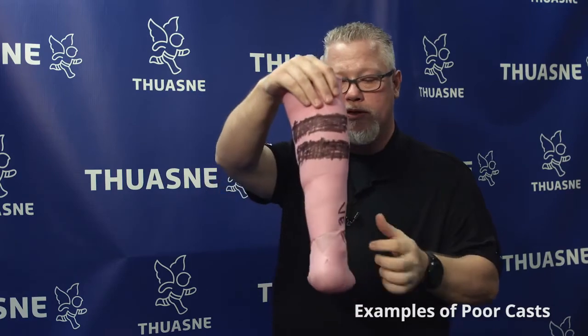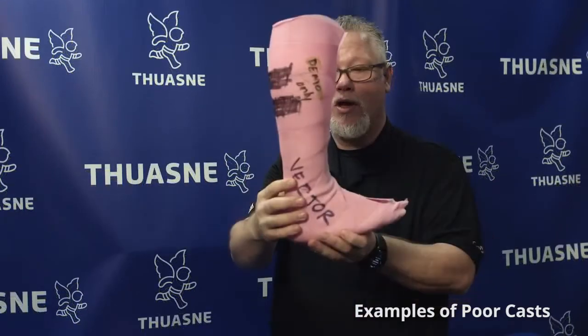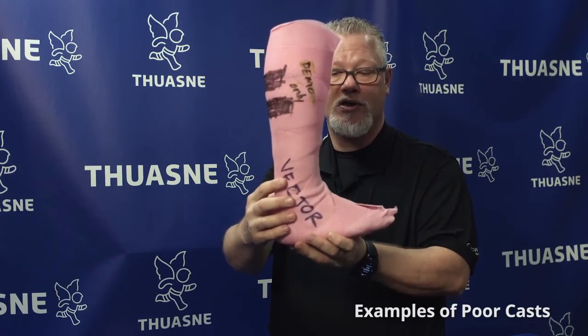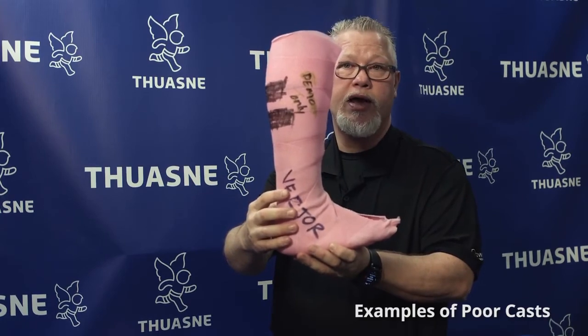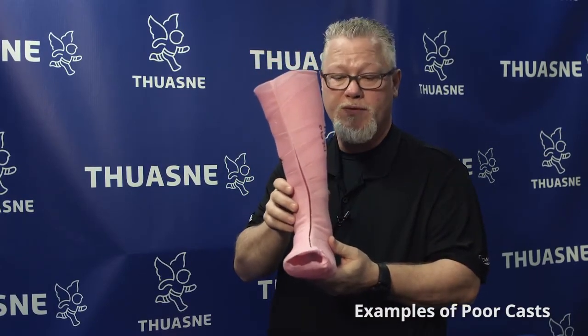So the forefoot in this particular cast is adducted, so we have a medial drift. If we flip, the hind foot is somewhat neutral, so that's good. And then we also are dorsiflexed, so we know that we have a negative heel height at this point. So this doesn't accurately reflect the heel height that was asked in the device. When we grab the left, the foot is not symmetrical to the right foot.